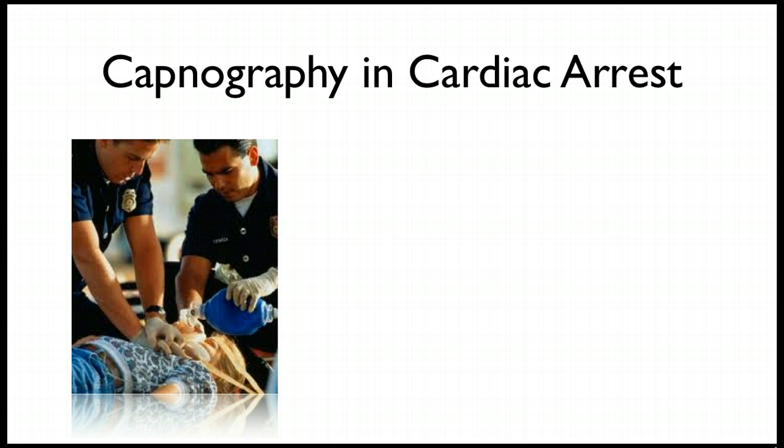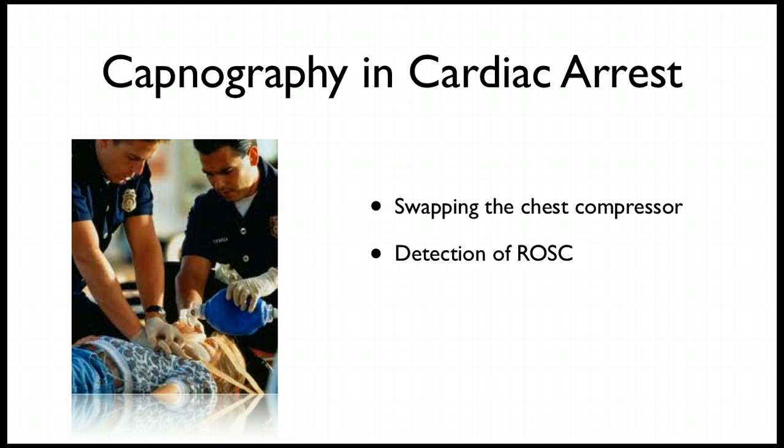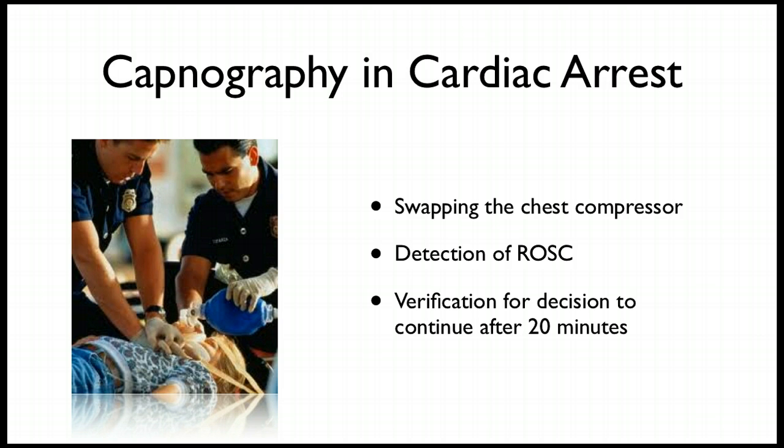So are you convinced yet? Here's a summary slide. Uses for capnography in cardiac arrest: for swapping the chest compressor, for detection of ROSC, and for verification of the decision to continue after 20 minutes.